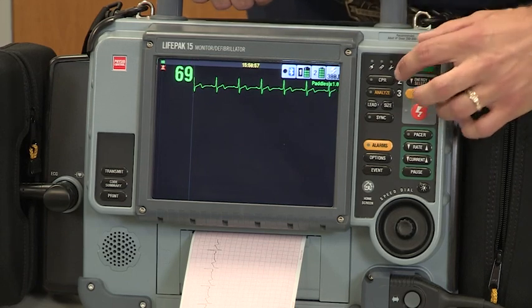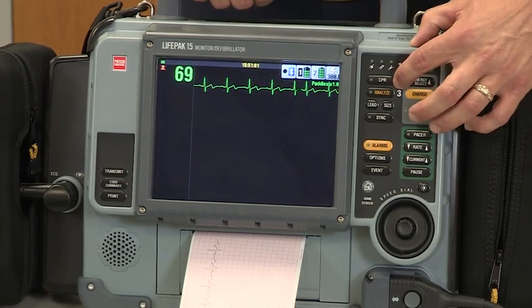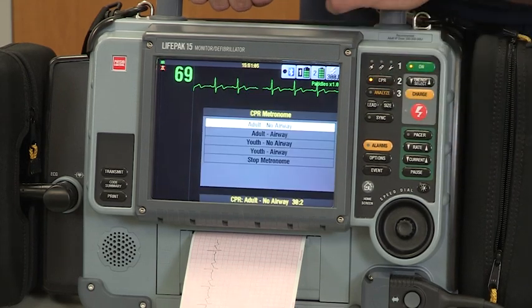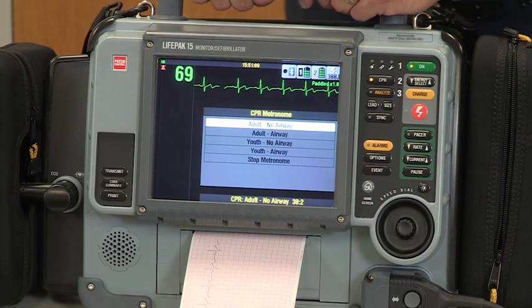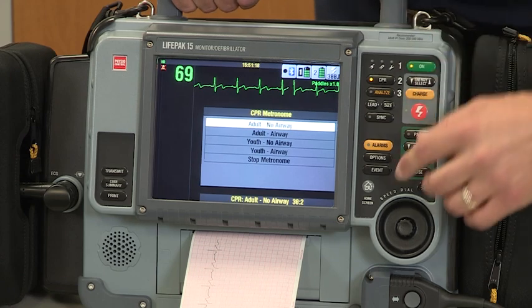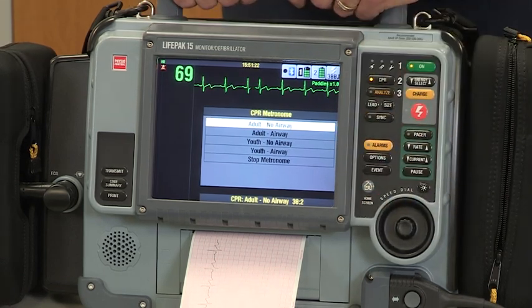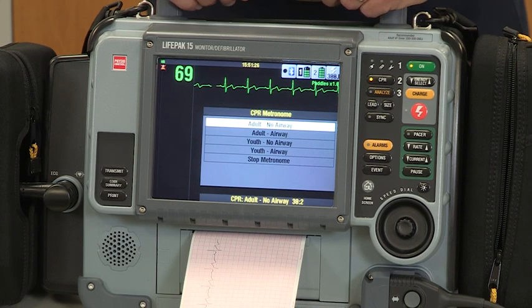Earlier I discussed that the LIFEPAK 15 has a CPR metronome. If you'd like assistance with the CPR compressions and the rate, push the CPR button, and the metronome will activate at a rate of 100 compressions per minute. With the metronome, you'll also get a voice prompt for ventilations. As you can see, it defaults to an adult with no airway, which is the 30 and 2 protocol. 3, 2, 1. Ventilate.